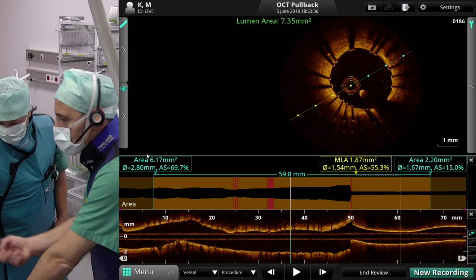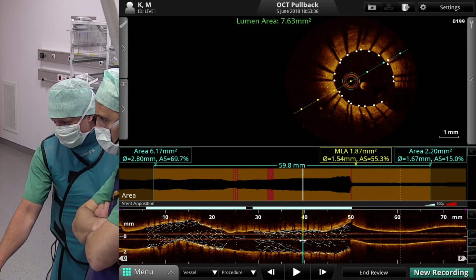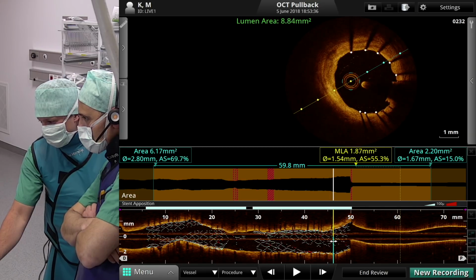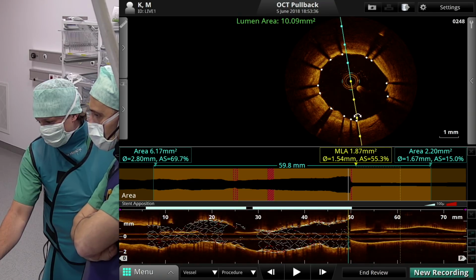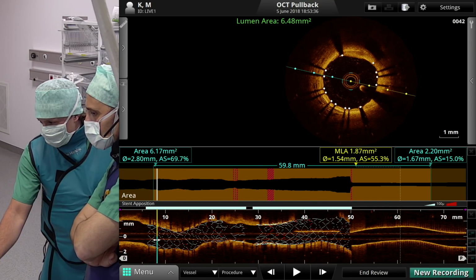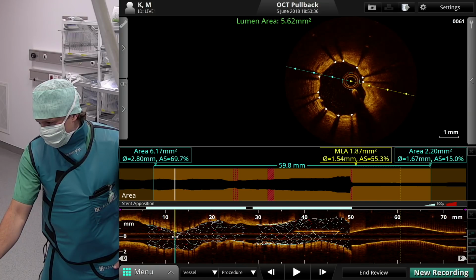So, what do you think of this stent? Yeah, in the rendered stent, it looks much better. Nicely opposed all the way through, and also in terms of expansion, it is a nicely expanded stent. Perhaps only the distal stent has still some degree of eccentricity that we could now improve. In the longitudinal view, you see very nicely how the stent is made tapered. No edge dissection.